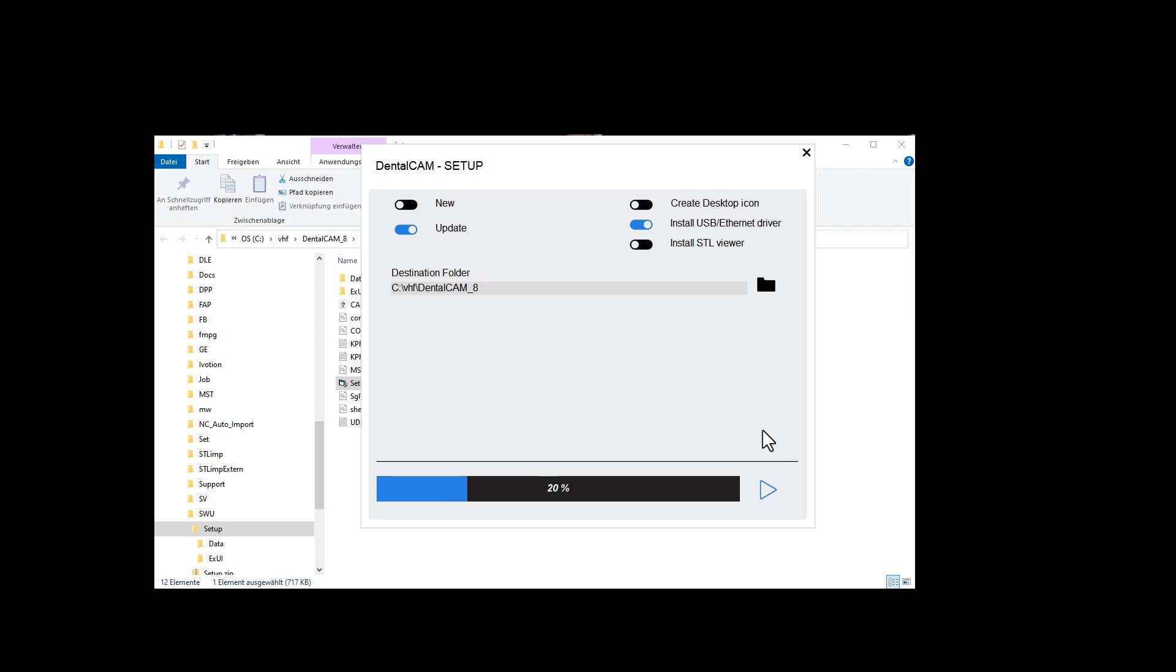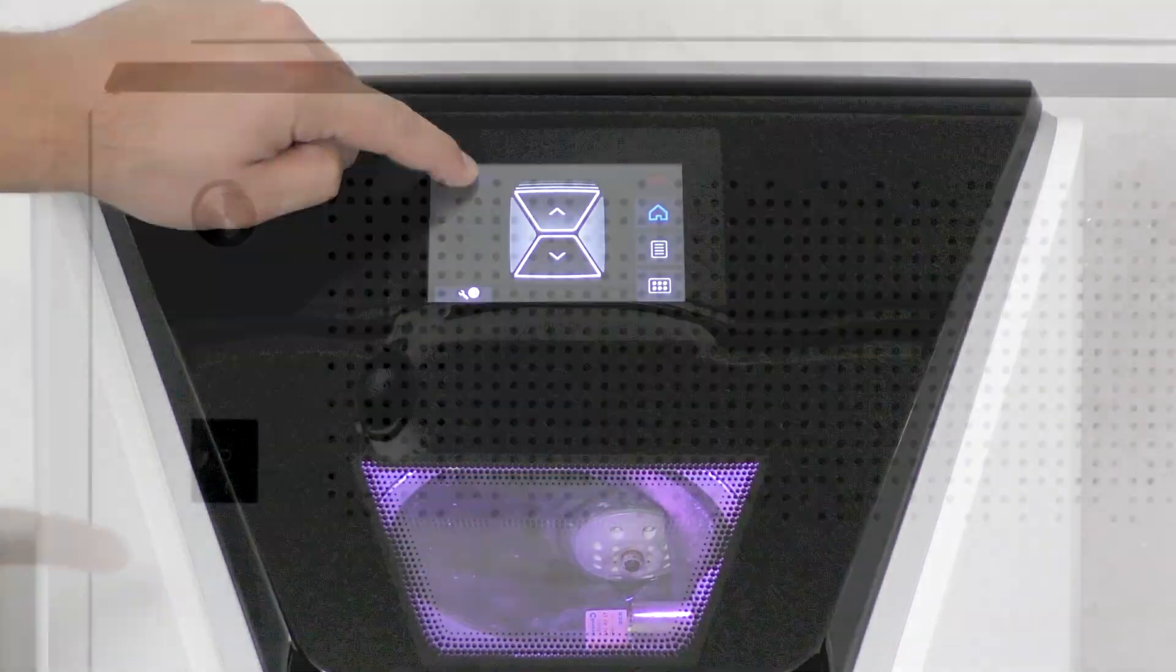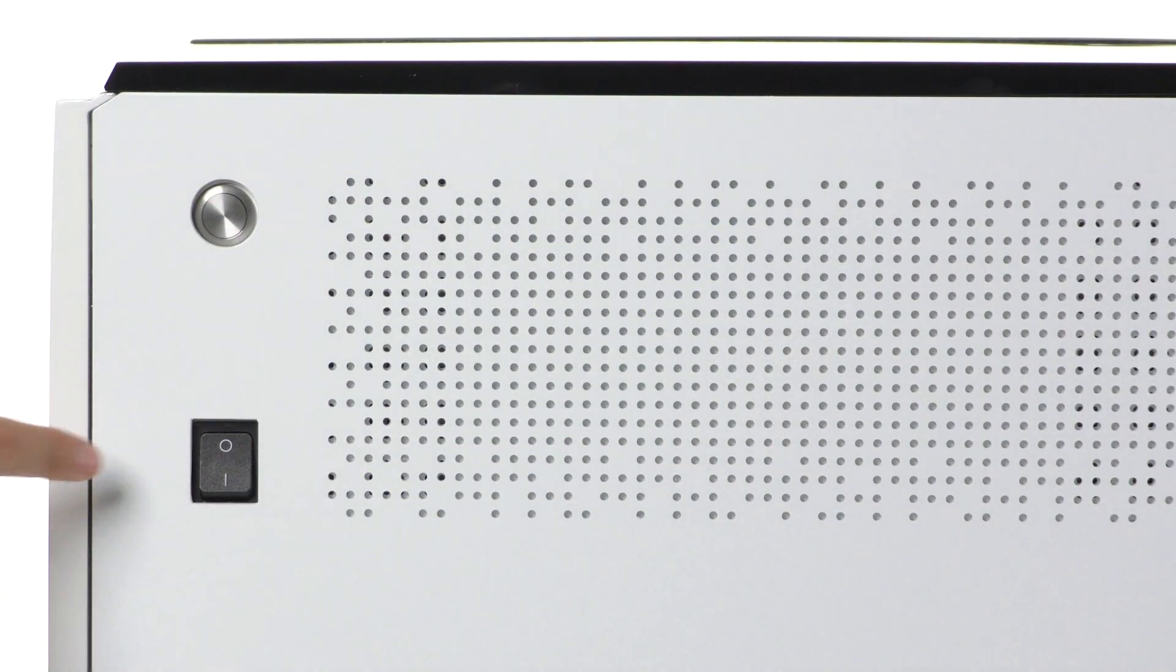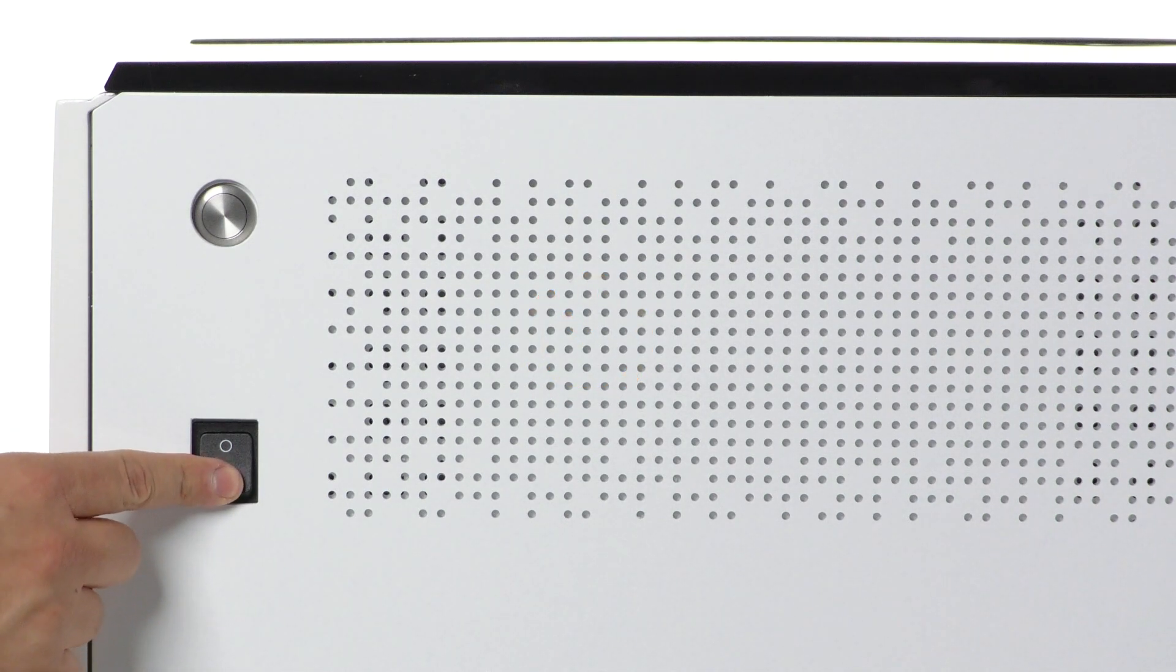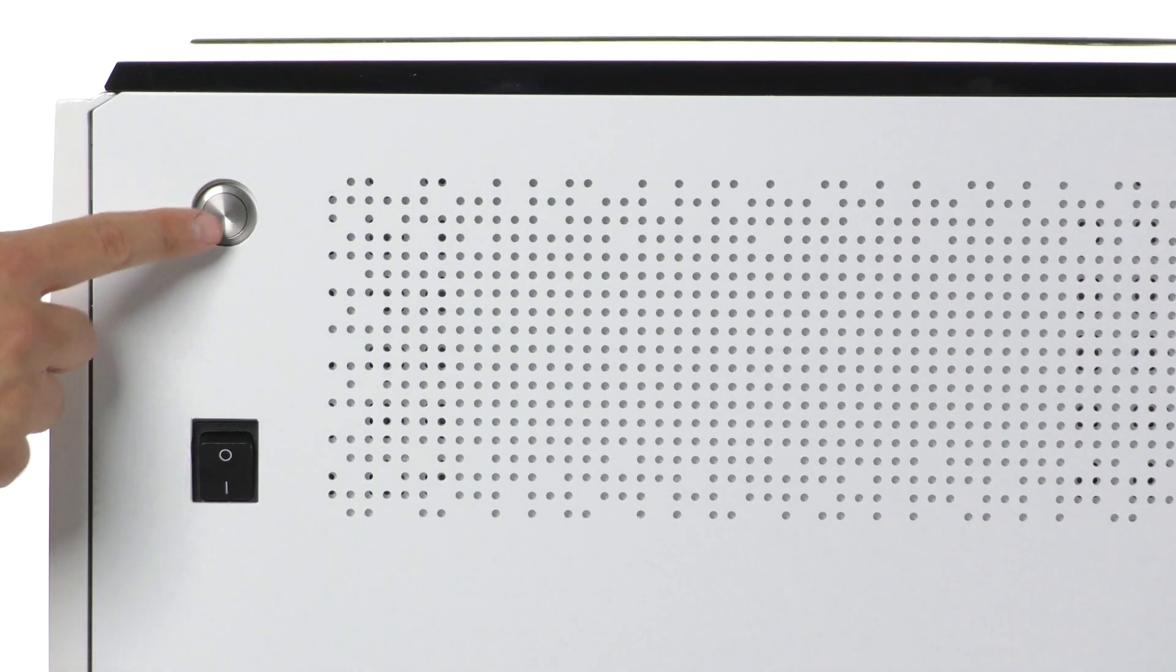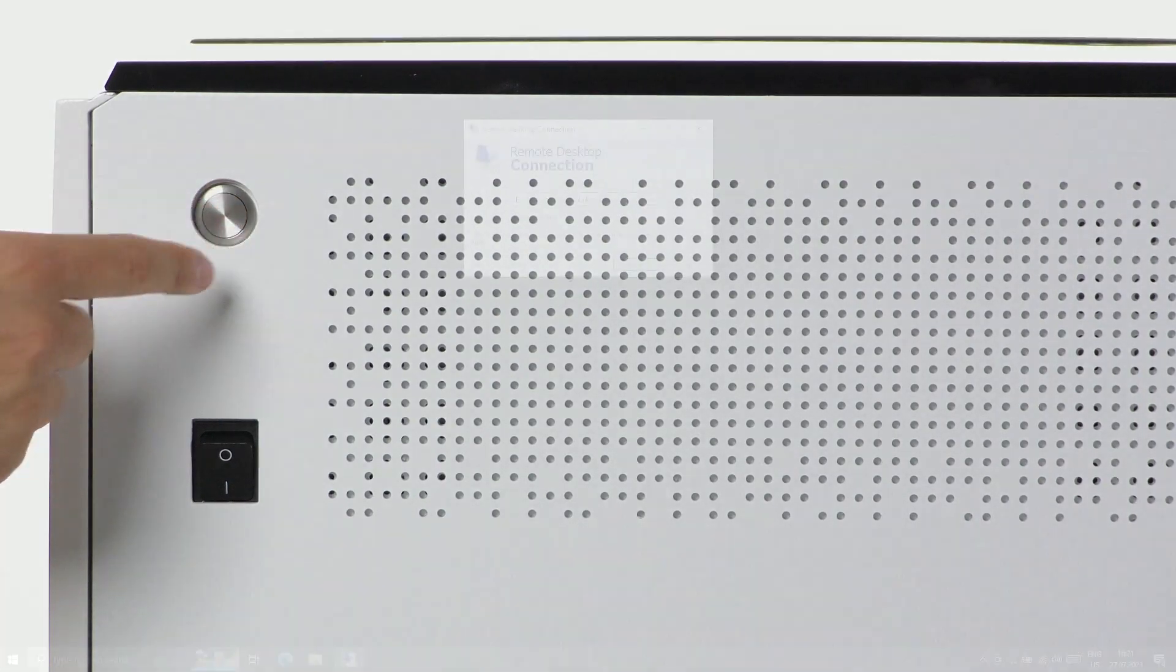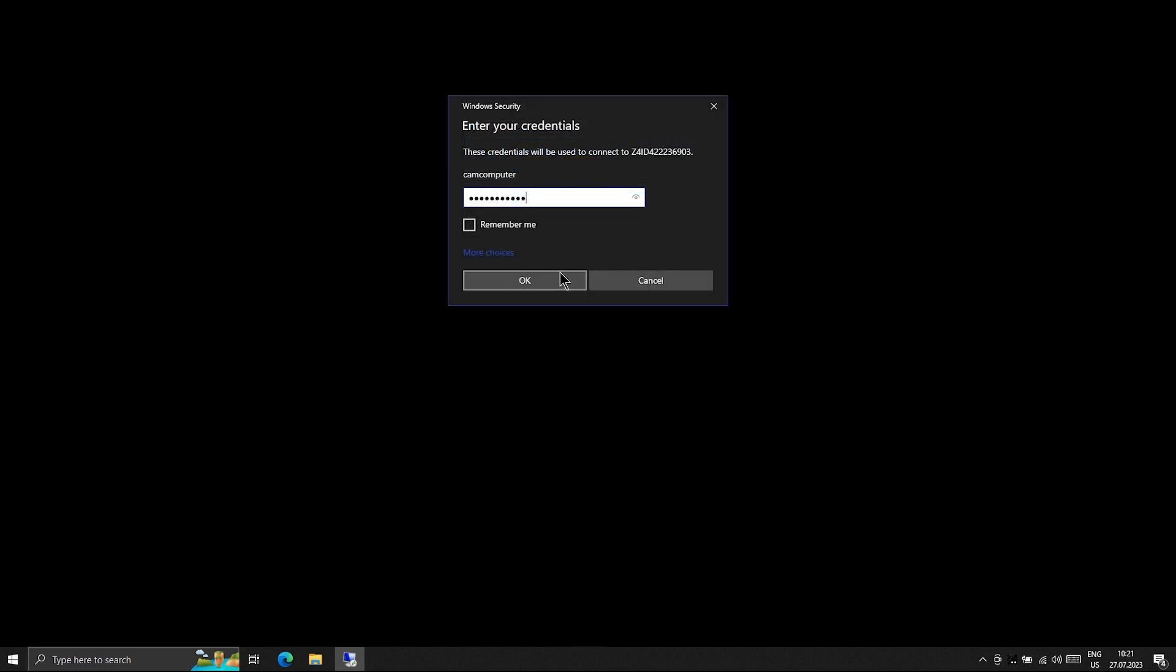After the update is installed, shut down the CAM computer and switch off your Z4 at the main power switch. Wait for 10 seconds. Start the machine including the CAM computer as you usually do. Access the CAM computer via the CAD computer, as already shown.